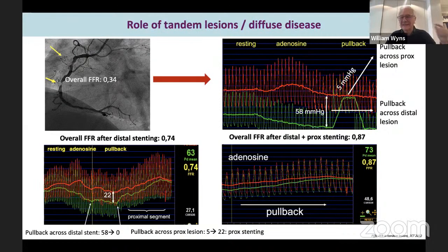Now, in the past, we had issues crossing with the stents, okay? Sometimes, if you stent proximal first, it might be very difficult to reach the distal. I may sound like a very old man now because that's not the sort of issue that you're dealing with, right? So you can select the one that looks the most severe to you. You treat it to the best of your capacity, and then you measure again, okay? And that measurement will be a more adequate measurement of the hemodynamic significance of the second one.